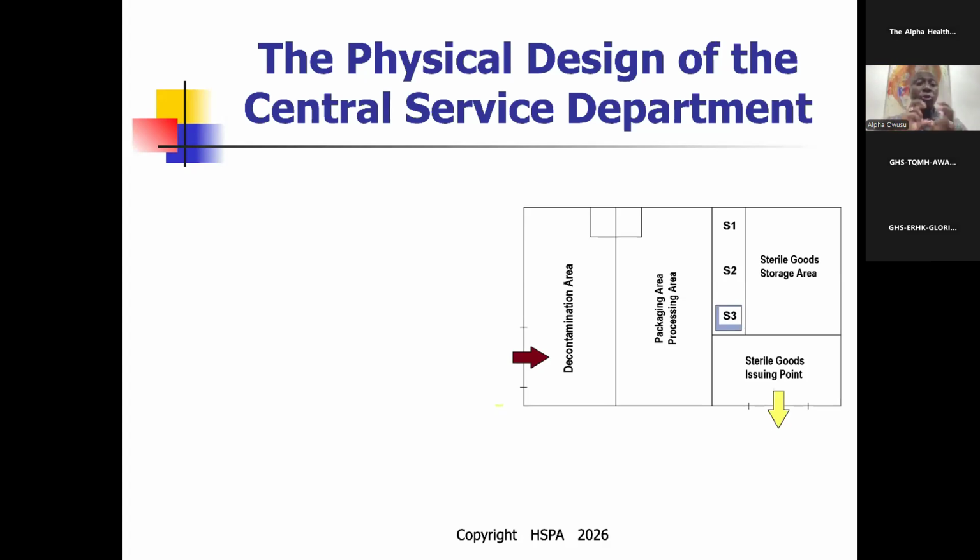And if there are doors, they should be closed at all times. Very, very important. Even within the whole area, there should be very, very minimal traffic.